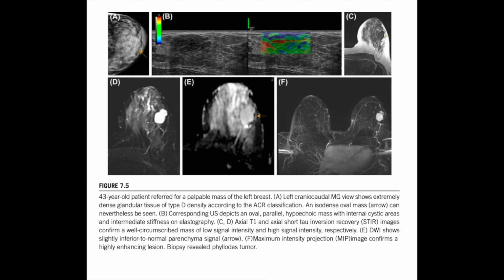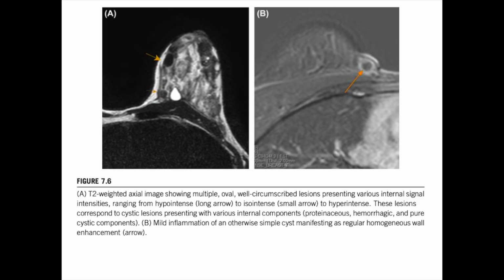It breaks down in the middle, the dreaded type 2 or the plateau curve. The ambiguous one. This is the critical ambiguous zone. A plateau curve where you have medium uptake, then it just kind of flatlines. You find that in both benign and malignant lesions. So that plateau, that's the real source of the ambiguity, isn't it?